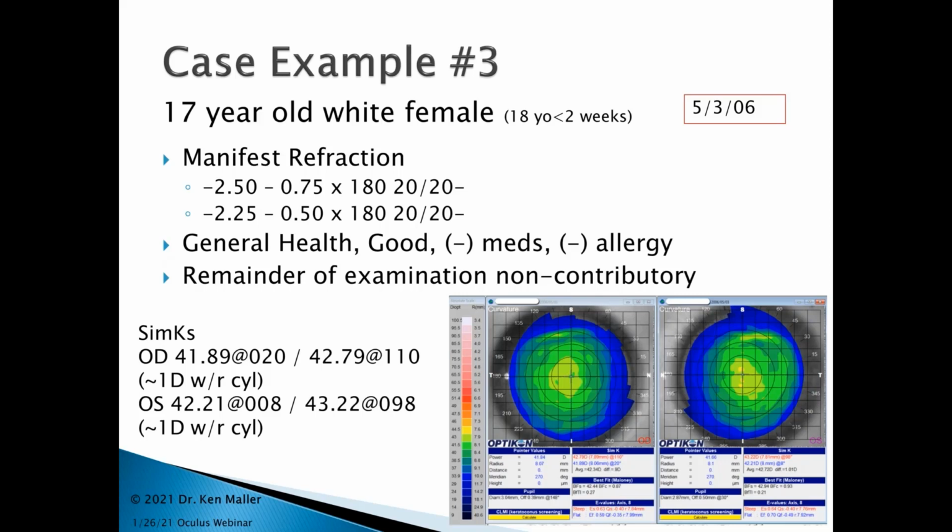And so since Ortho-K is becoming much more commonly done in the young population, I think getting rear surface corneal measurements, such as the Pentacam can give to you very easily and quickly, becomes really much more vital to screen a lot of these patients before we put them into Ortho-K.